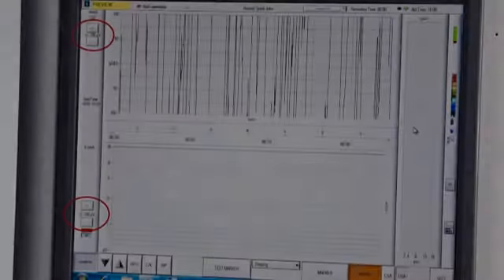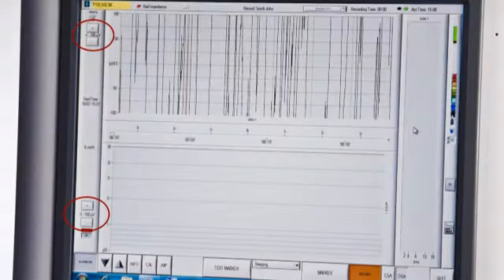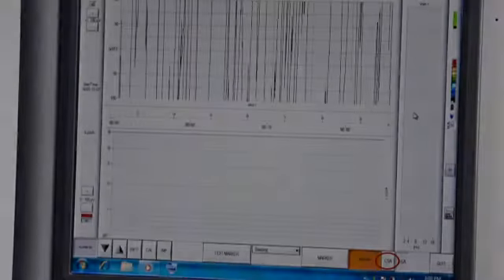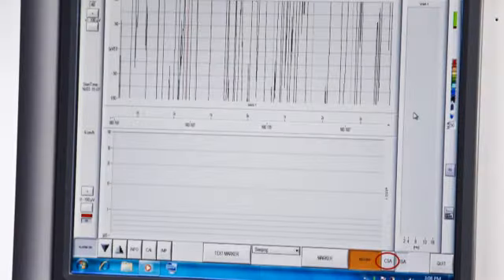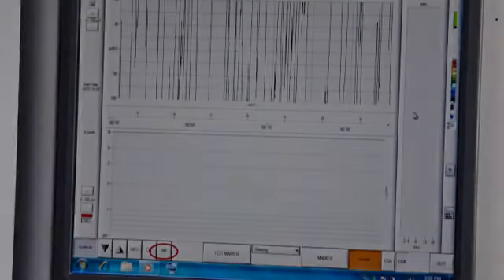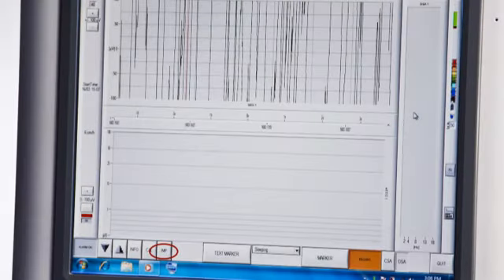To adjust the EEG and AEEG scales, you can use the scroll keys on the left-hand side of the screen. You can switch between CSA and DSA or you can switch it off altogether.